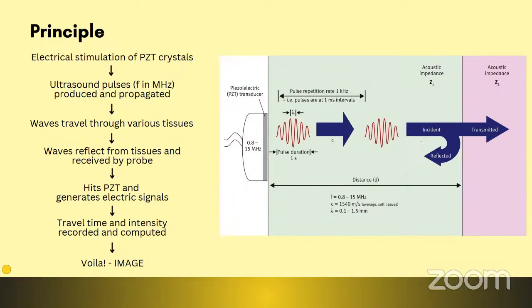We have learned about this in optics, right? We have something called refractive index. It tells us more about the density of the medium. The more the density, the more the refractive index, the more the electromagnetic wave would be influenced by it. Likewise, when it comes to longitudinal waves, which is sound waves, we have something called acoustic impedance. Impedance translates to resistance. So the denser the tissue, the higher the acoustic impedance.